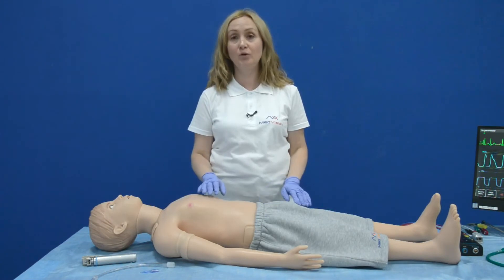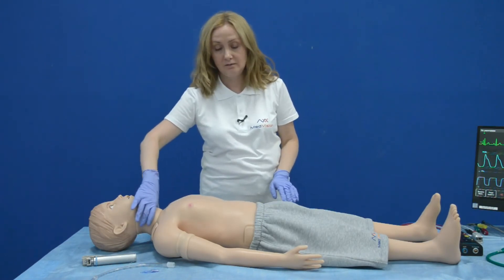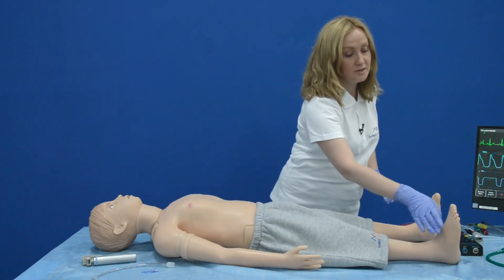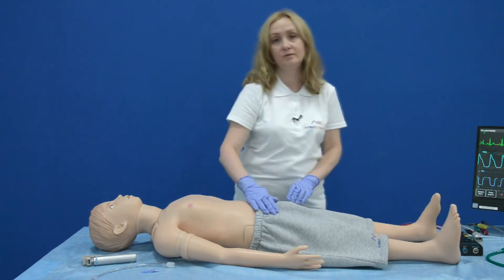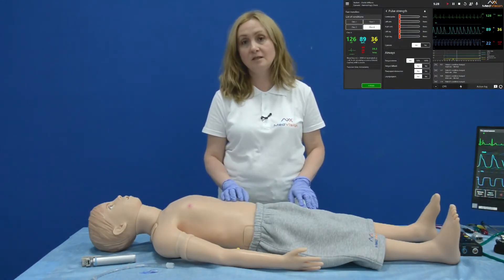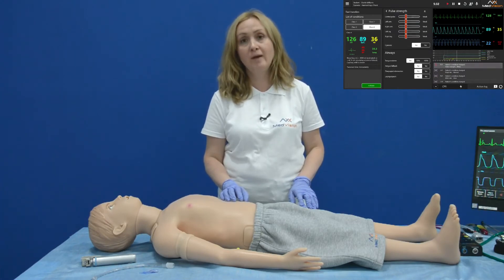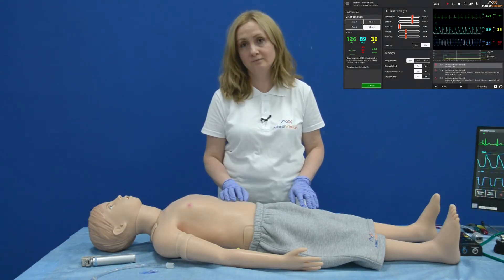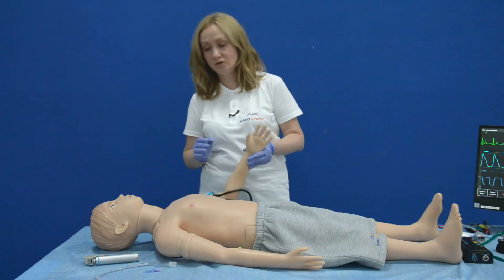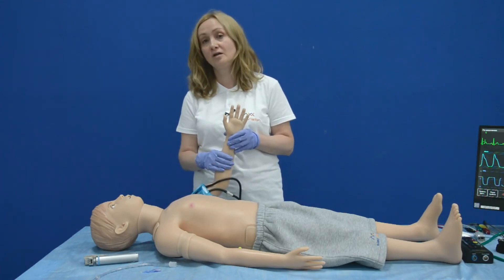Arthur supports palpable pulse — bilateral carotid, brachial, radial, tibial, dorsalis pedis, and femoral. Each pulse is programmable and you can make relevant settings in the software, adjusting pulse strength to weak, strong, normal, or none. Another feature is that you can measure blood pressure using a BP cuff, and Arthur can produce the Korotkoff sounds.